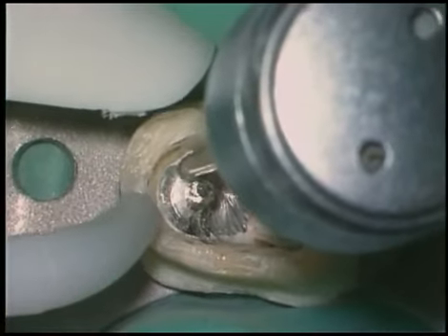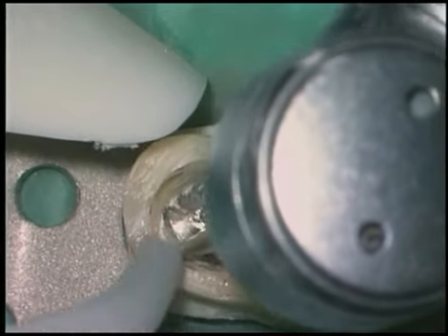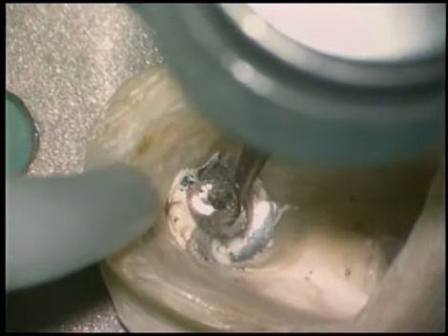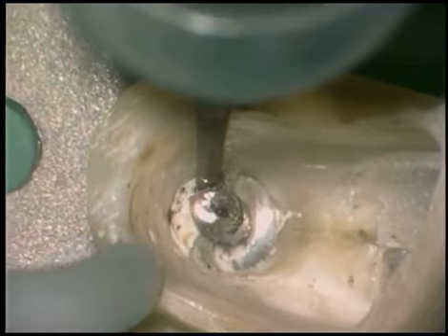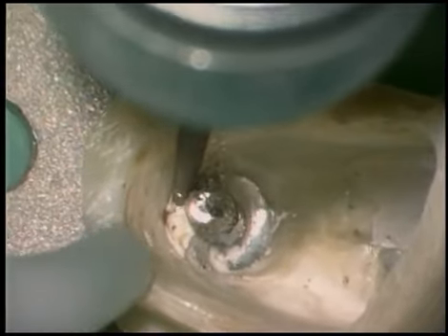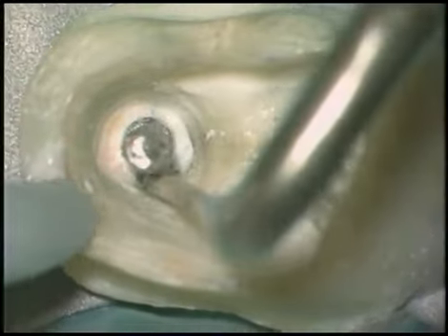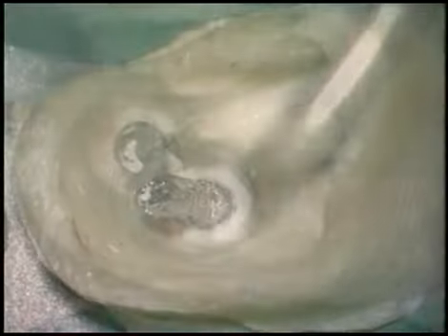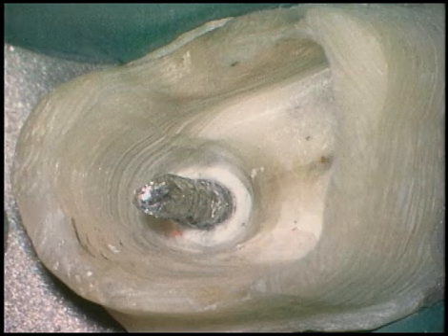So just sculpt away very lightly out on the perimeter. This will keep the post intact. If space exists between the axial wall and the post, use appropriately sized surgical length carbide round burs or thin tapered diamonds to eliminate remaining buildup material. Once we've eliminated the bulk of the amalgam, and if space exists, use ultrasonics below the orifice to remove restorative materials. When fully exposed, vibrate the post up to 10 minutes with the Endo 1.